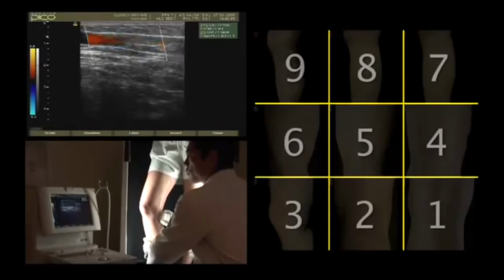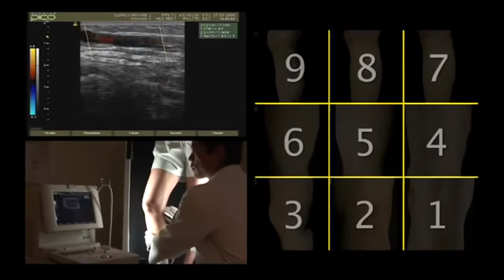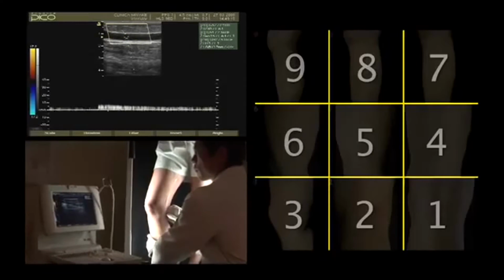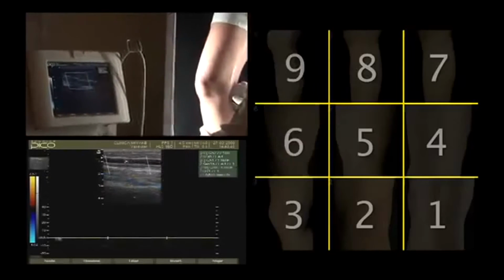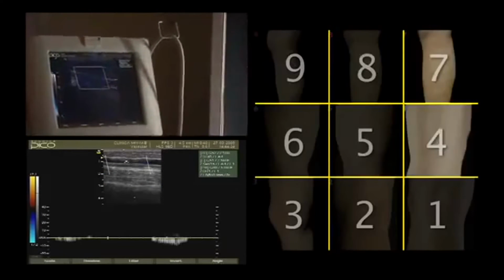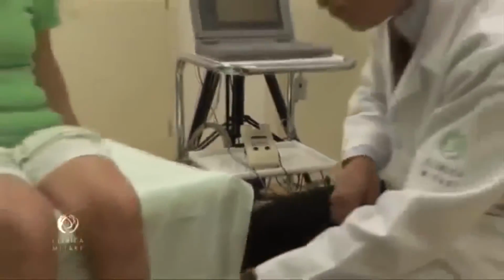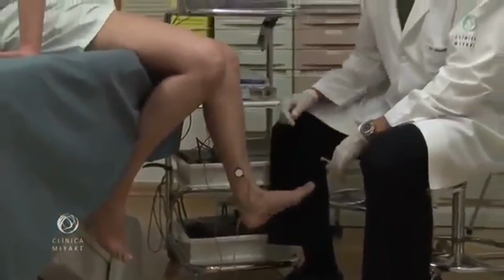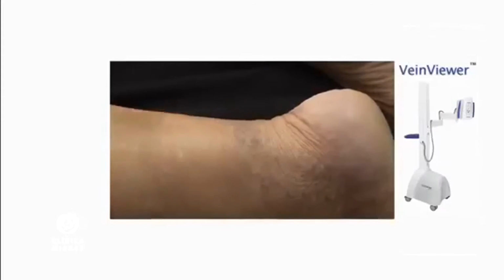As we all know, a patient with feeder veins may have no complaints of heavy legs, nor edema, but may surprisingly present insufficient saphenous veins during ultrasound scan. Thus, the ultrasound truly establishes if the patient scores 9 instead of 6, 8 instead of 5, or 7 instead of 4. For the borderline cases, photoplethysmography is important to evaluate the meaning of the reflux for a given patient and validate the ultrasound findings towards venous insufficiency.